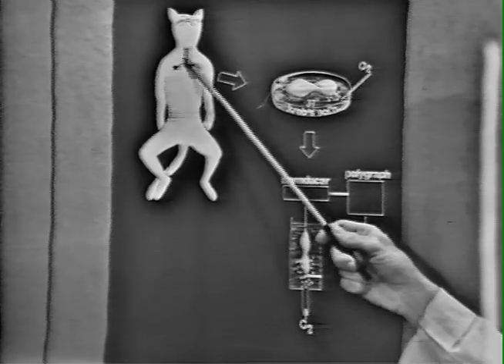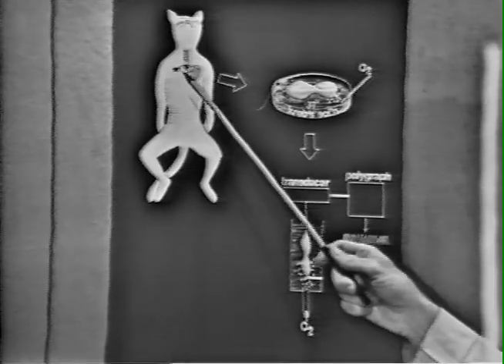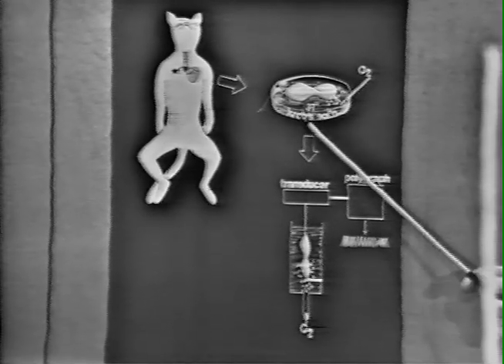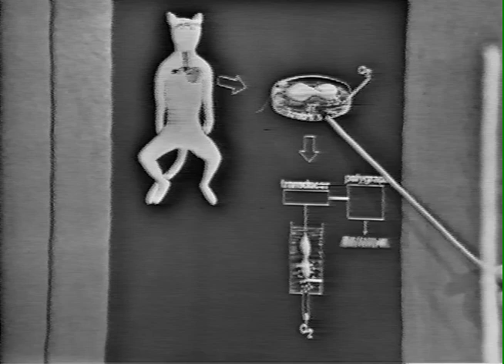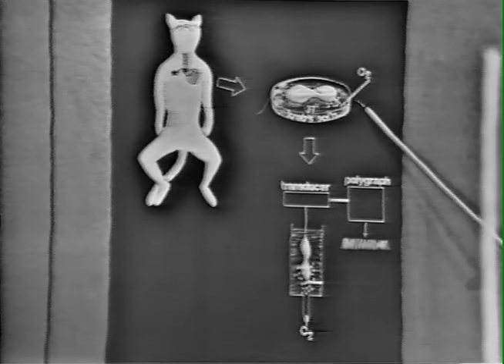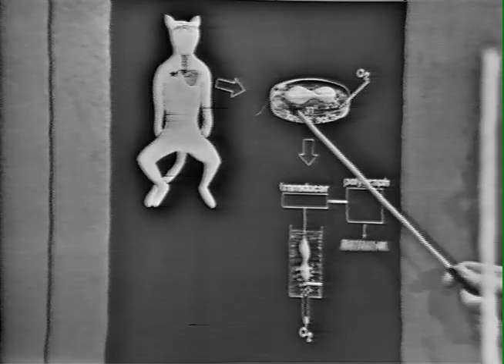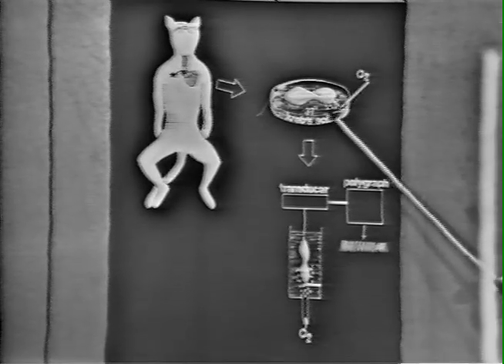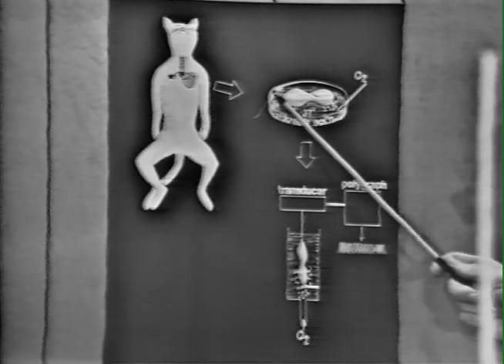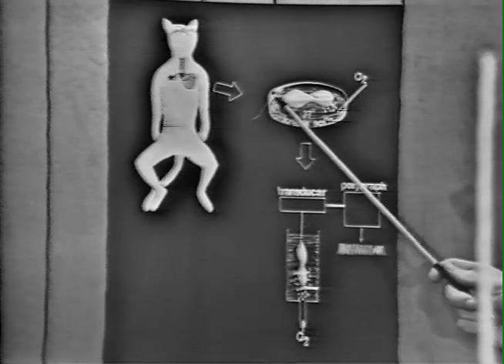We isolate the entire tissue mass and remove it from the thoracic cavity into a dish containing Krebs physiological solution at 37 degrees and aerated with oxygen and CO2. At this point, we clean up the atria, that is, we remove lung tissue, ventricle tissue, adhering fat and blood tissue, and clean up the ganglia and the nerve as well.